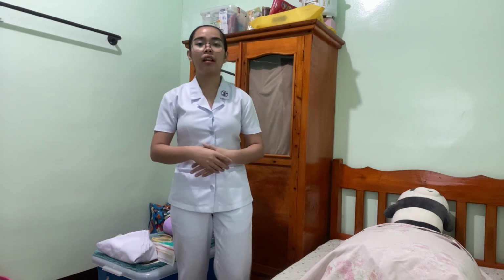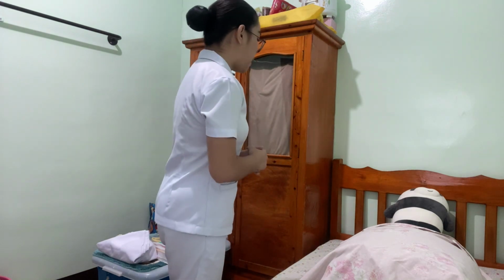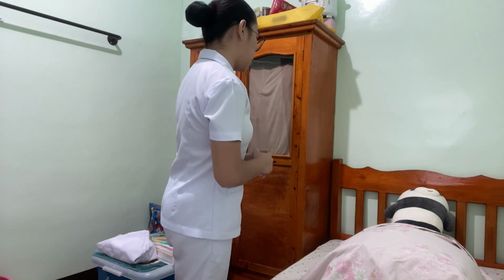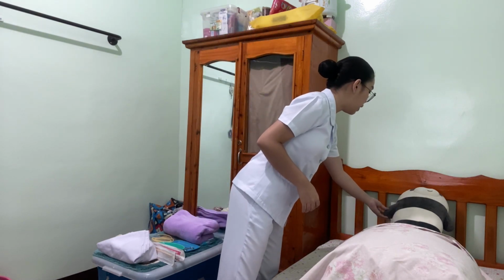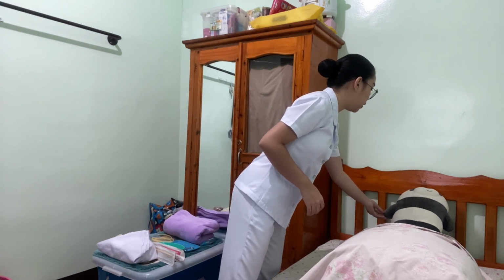So after that, we have to introduce ourselves to the patient and identify the patient's identity using the two identifiers to ensure that we are doing the right procedure to the right patient. So, good morning, ma'am. I'm Nikka as Pilas, your student nurse for today. So, may I see your wristband, ma'am? Please state your complete name and your birthday. Okay, so how would you like me to call you?